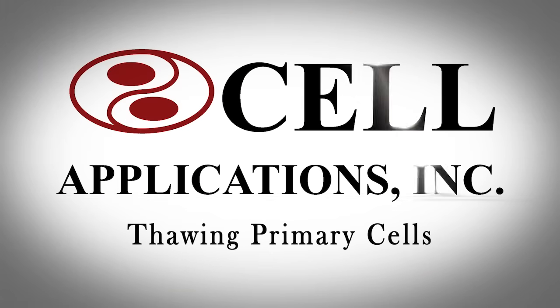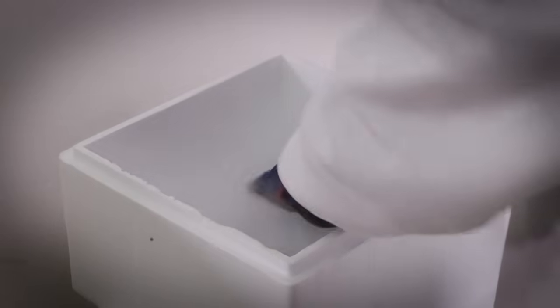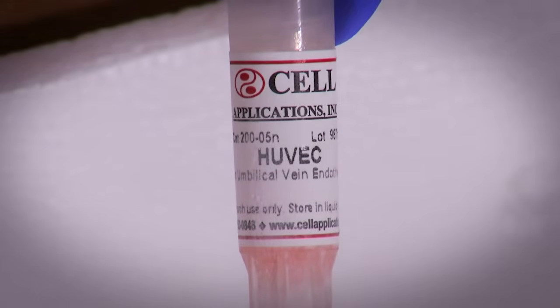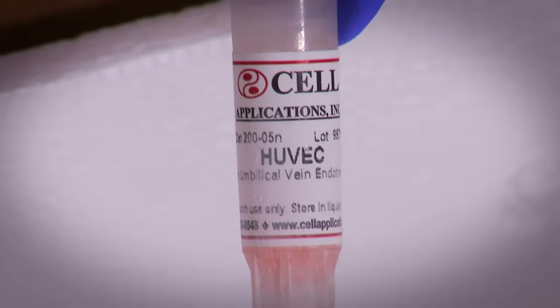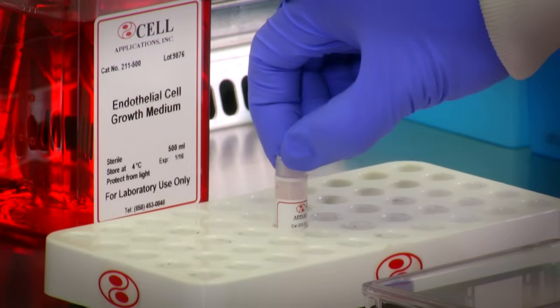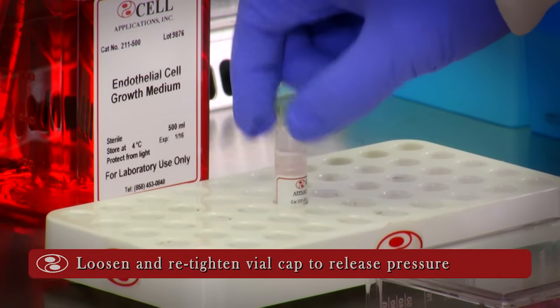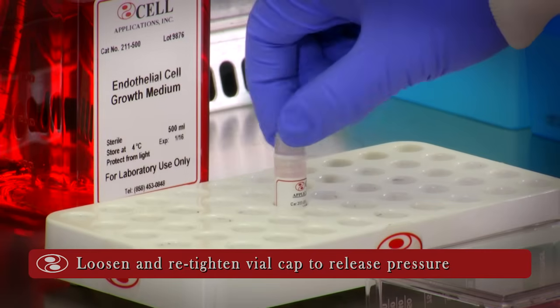Thawing Primary Cells. Fill an insulated container halfway with dry ice pellets. Retrieve the cryovial from liquid nitrogen storage and immediately submerge it in dry ice until ready for use. Turn the vial cap one quarter to release any liquid nitrogen or pressure that might have built up in the cryovial, and then retighten it.